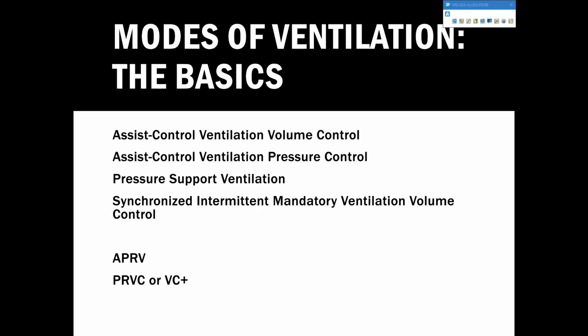Okay, I'm going to skip APRV for a second here, and we're going to talk about PRVC or VC Plus on our 840 980. Okay, so what this is doing is it is taking the best of both worlds. We are going to talk a little bit about the advantages and disadvantages of each mode in just a second here.